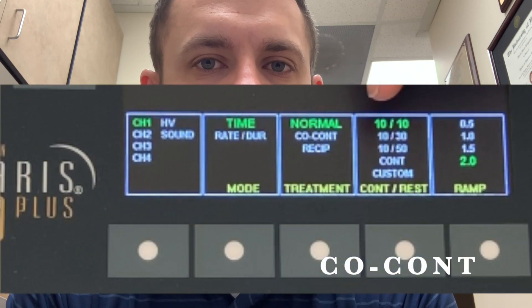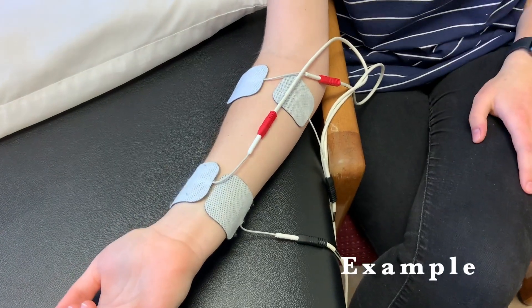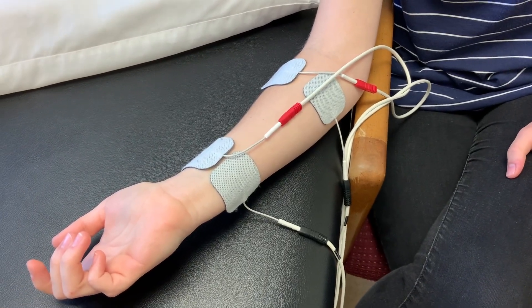If when you're setting up Russian you see on the patient chart 'co-contract,' that means you are setting up two different channels of Russian and they will contract together. You would set up a red and red, and a black and black, on those machines, then turn up each one individually. When you press start, both sides will contract at the same time. Russian co-contract means you're getting two channels going simultaneously — so they're contracting at the same time.